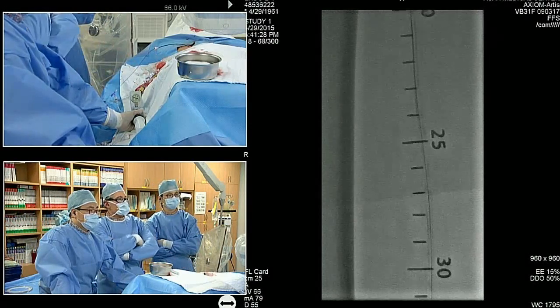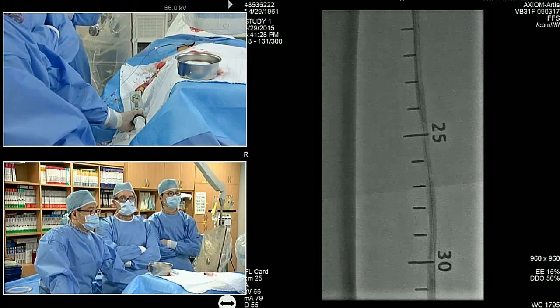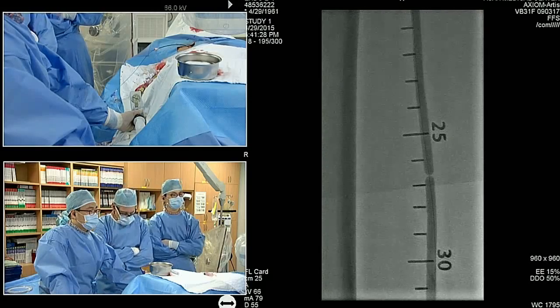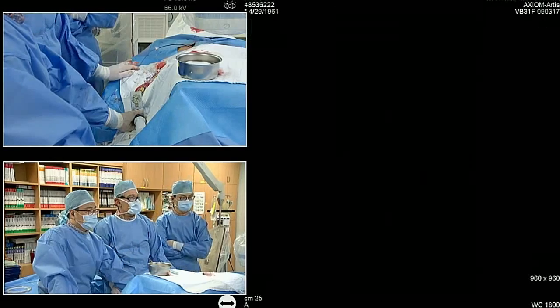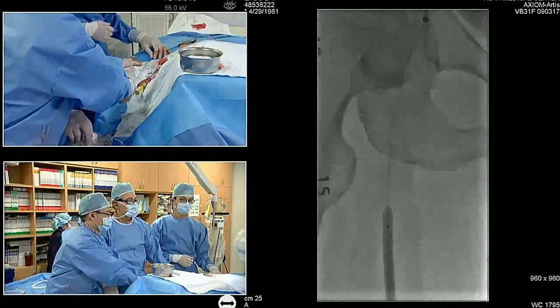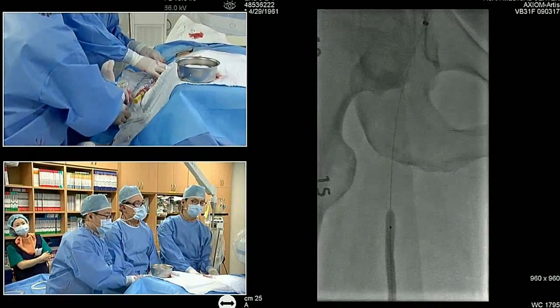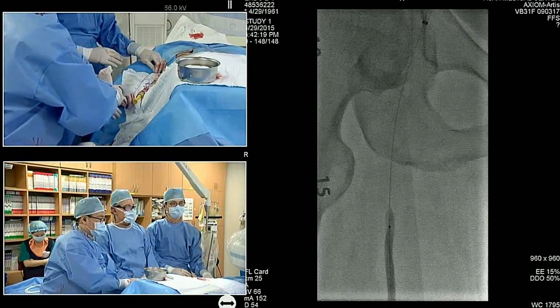It's a big vessel. According to the guide shot, I would say it's at least a 6. Yes. Although he felt the 5-millimeter balloon. Okay, I think you can come down and we can go to the top. Yeah. Tell him sorry. Should get better. It'll get better. A little medication.